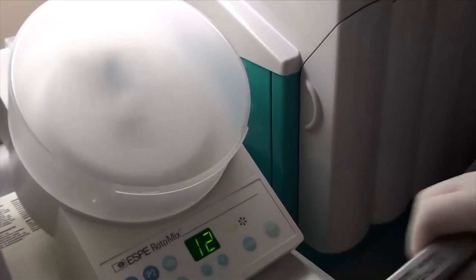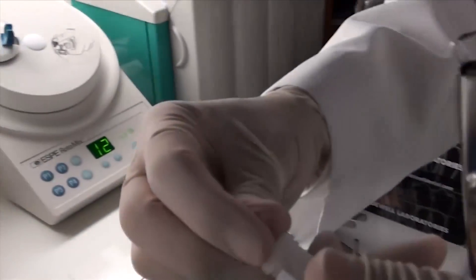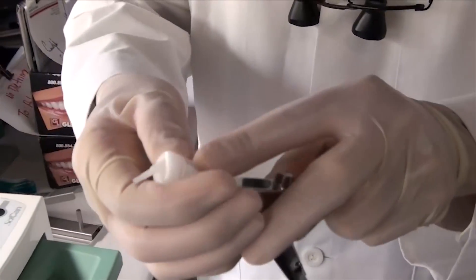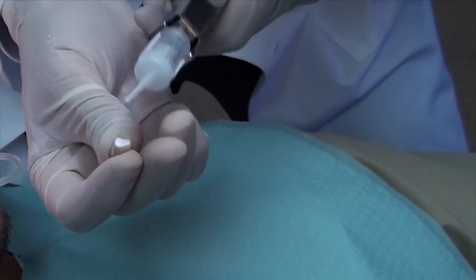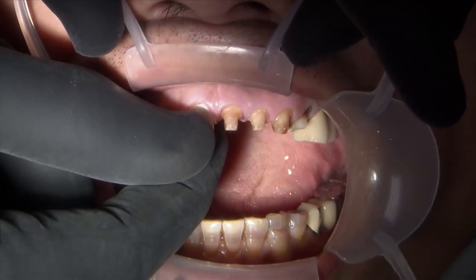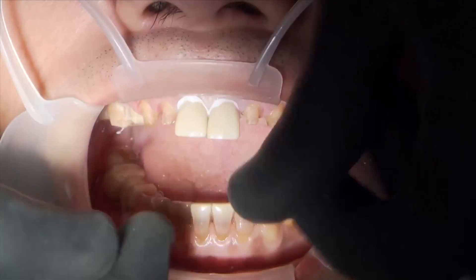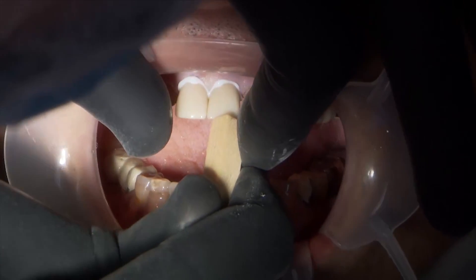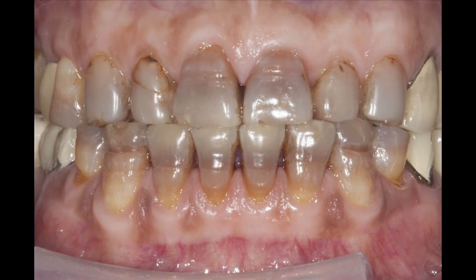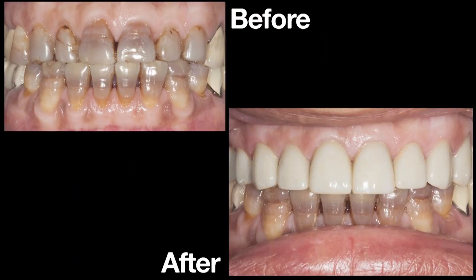We're using Ceramer from Doxa — a calcium aluminate glass ionomer cement — and we're going to triturate it here. This is a very hydrophilic cement. Just like the Bruxer material, it is very hydrophilic. If we put Z-Prime Plus on the inside of the crown, it would actually not work, because the Ceramer cement needs to be in contact with the zirconia oxide. In fact, Ceramer really doesn't even care about the contamination, so I could have placed these crowns without the Ivoclean step — but once you know you've got salivary phosphates there, I just like knowing the inside of the crowns are clean.